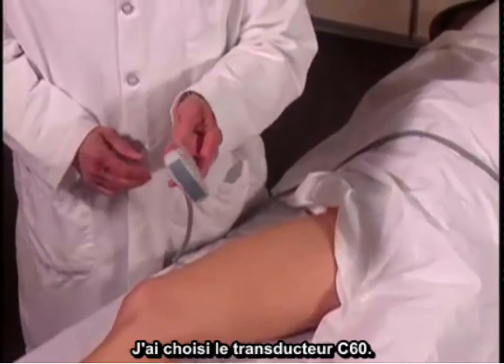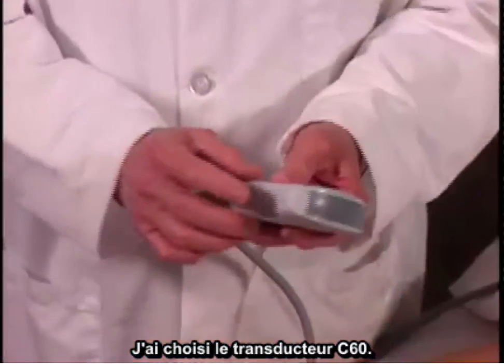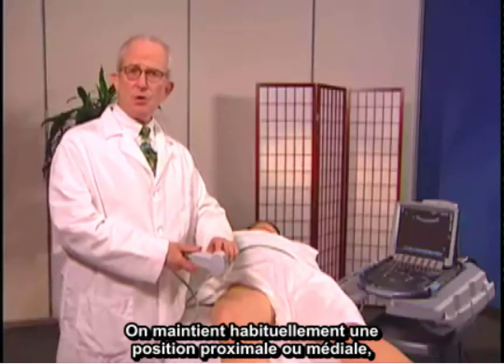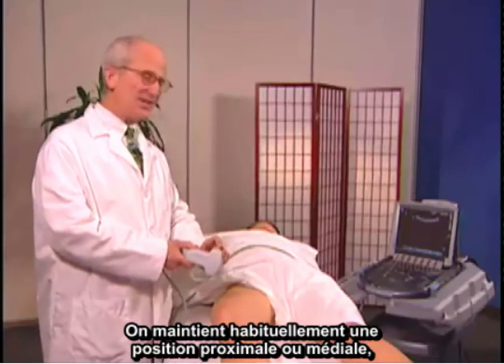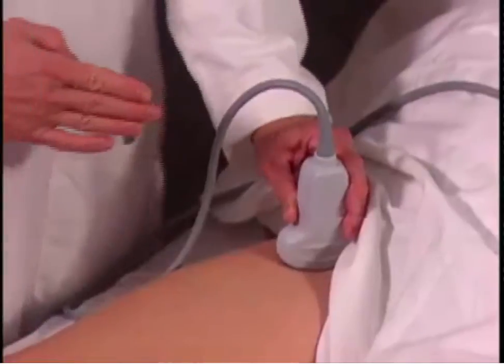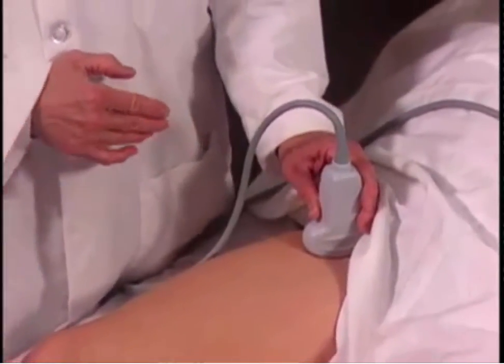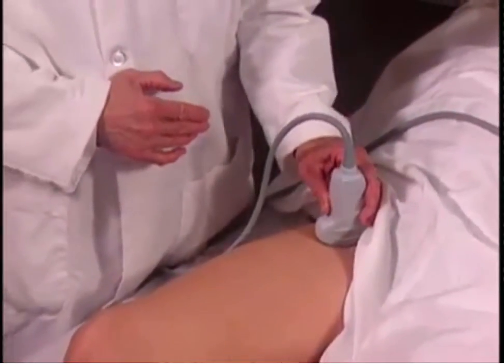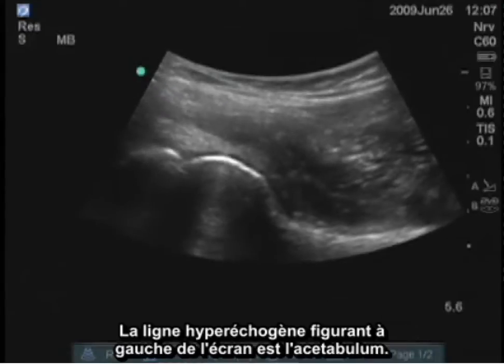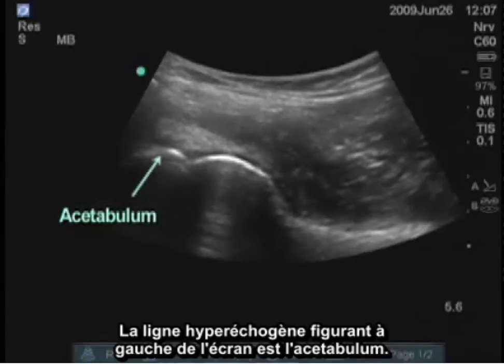I've chosen a C60 transducer. There is a line here which corresponds to the turquoise dot on the screen, and this we usually by tradition keep proximally or medially, and that's the way I'll orient this image. I'm trying to align the transducer approximately parallel with the femoral neck, and the left side of the screen shows a hyperechoic line, which is the acetabulum.